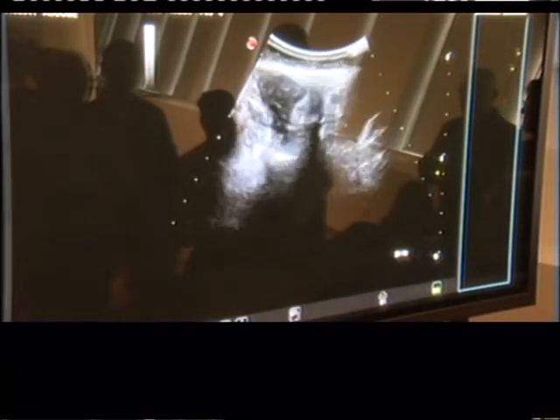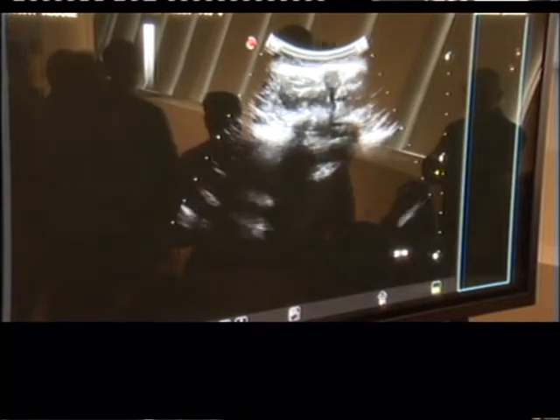Okay. So there's sacrum. Fifth lumbar. Fourth lumbar. Third lumbar. 2. 1. See, spinal, this is the cauda equina. Right there, anterior epidural space, posterior epidural space. Good vision.